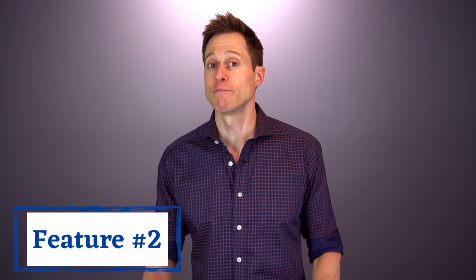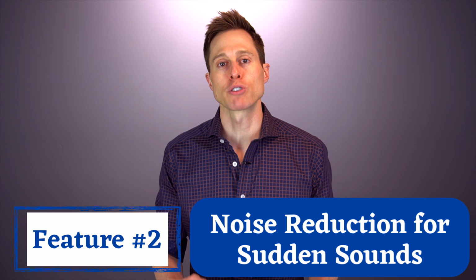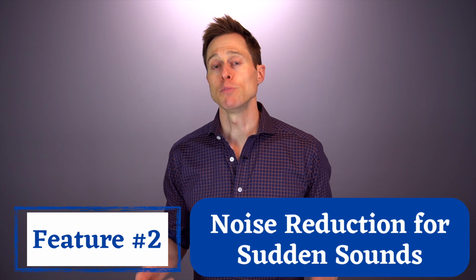The second lesser known hearing aid feature that you may not even be aware of but should is something called noise reduction for sudden loud sounds. Now, you may already be aware of a feature called noise reduction, but noise reduction is typically used to reduce the amount of amplification given to steady state noises in your environment, like a fan or a vehicle engine. However, when it comes to sudden loud sounds, hearing aid circuits are designed not to adjust amplification levels too fast because it can create distortion. That's why having a different type of noise reduction that is designed to reduce these sudden loud sounds is so important inside of a hearing aid.